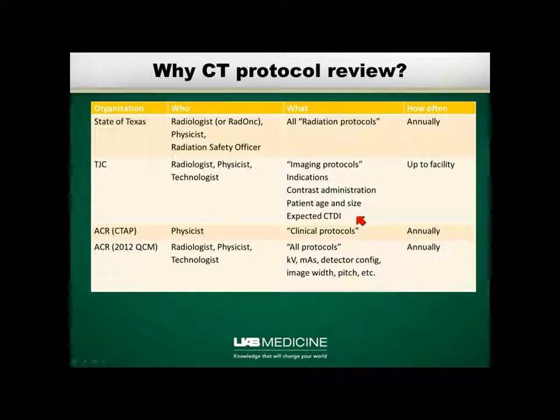However, the quality assurance manual, quality control manual, is a little bit more detailed. They want the radiologist and the physicist and a technologist involved in an annual review of all the protocols, and this is a fairly detailed review involving kV, mAs, detector configuration, image pitch, and so forth.